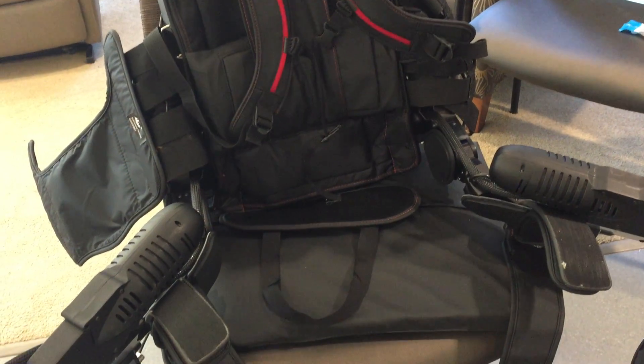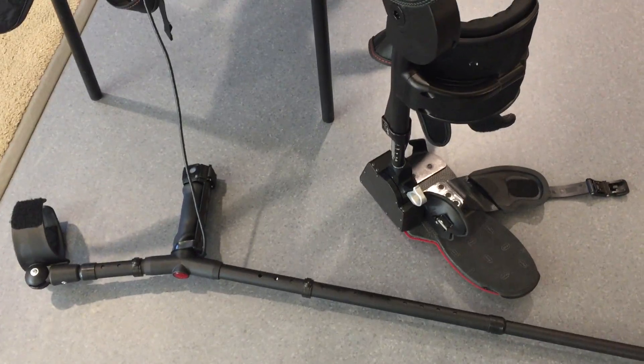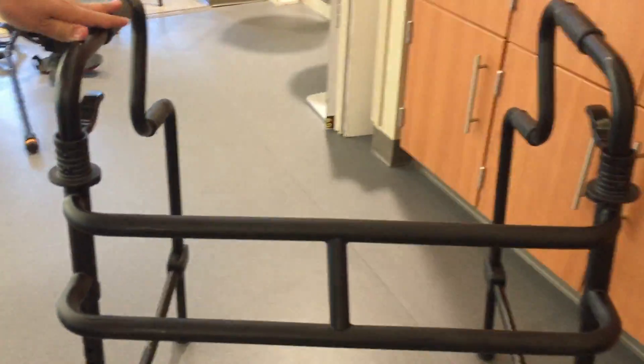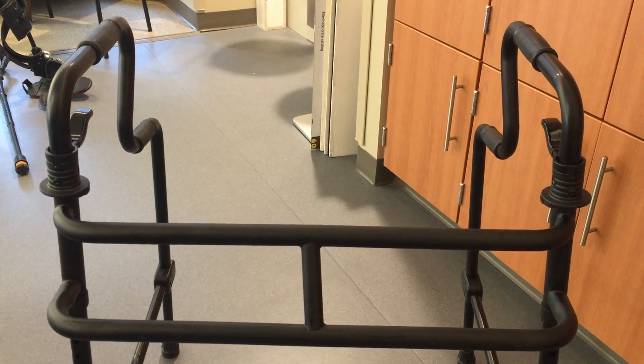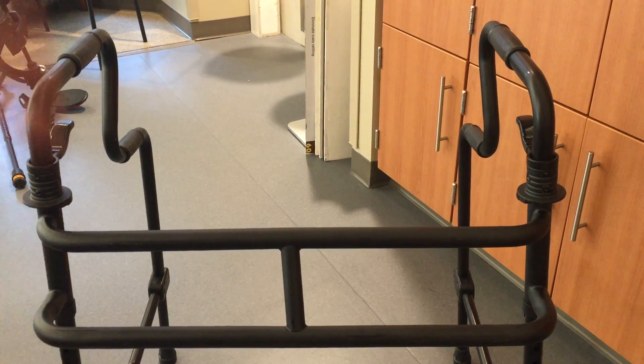As for whether they need to be supported the whole time, we actually have a walker that we use — it's a little bit wider than a standard walker — to help patients with the weight transfer from sitting to standing. The suit is fully powered, so they shouldn't need assistance unless they have a weak arm. A therapist may support their arm to get them up, but the suit will fully power them upright.